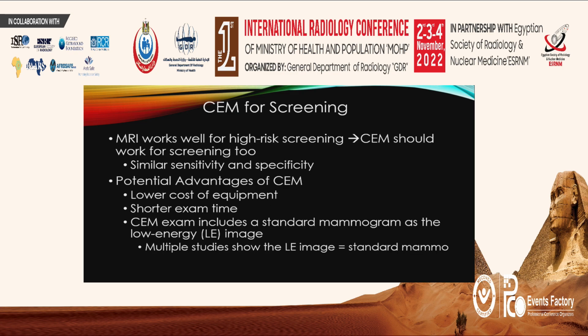A few words about using CEM for screening. So MRI works well for high-risk screening, so you would expect CEM would as well. CEM has some potential advantages, namely lower cost of equipment and shorter exam time, which makes it a lower cost test. An extra bonus is that with CEM, you also get a regular mammogram in terms of the low energy image. So that image has been shown in multiple studies to be equivalent to a regular mammogram. So you can use it to find calcifications. Whereas with MRI, typical screening is MRI plus standard mammography.